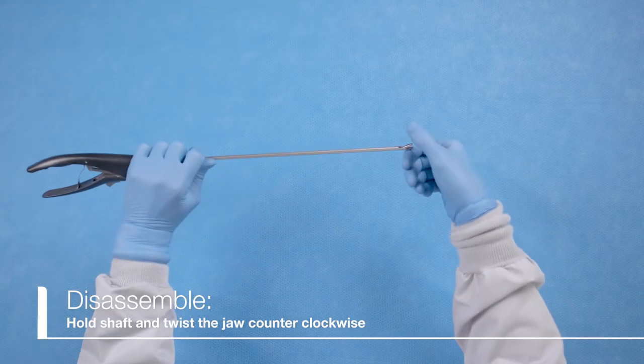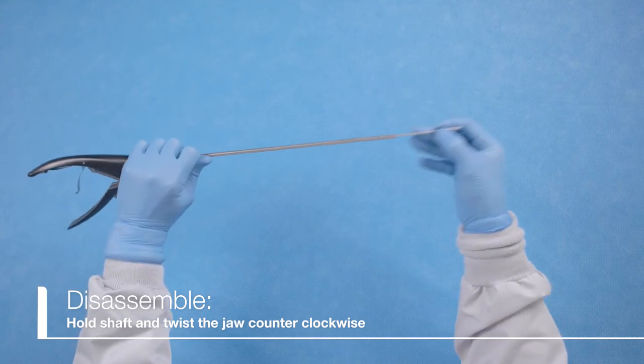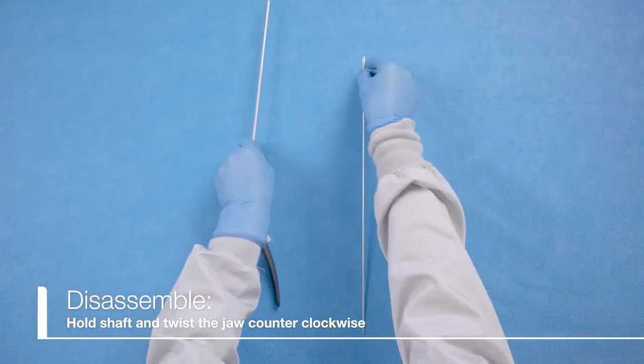In order to disassemble the needle holder instrument, hold the shaft and twist the jaw in a counterclockwise fashion.